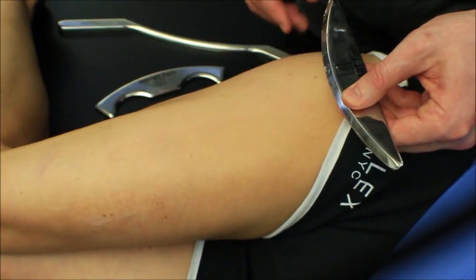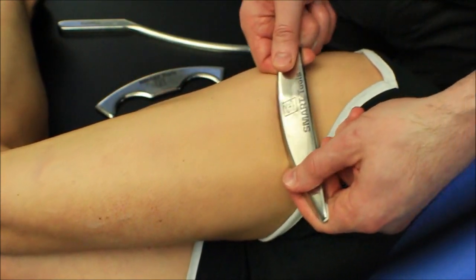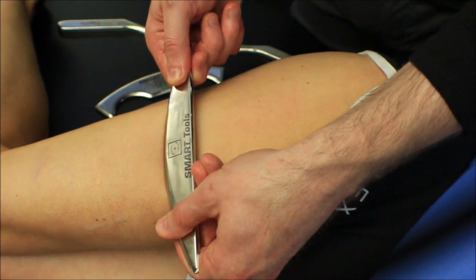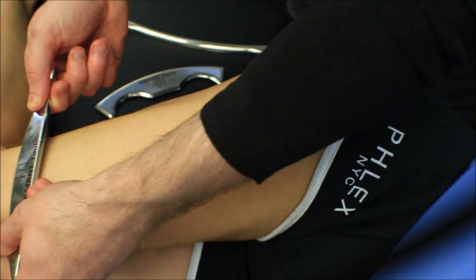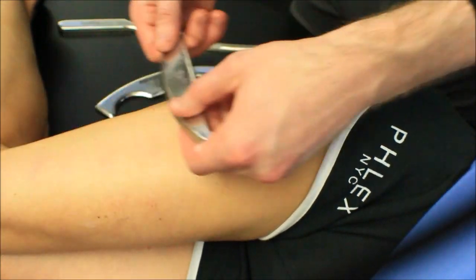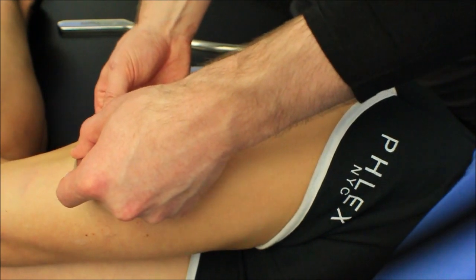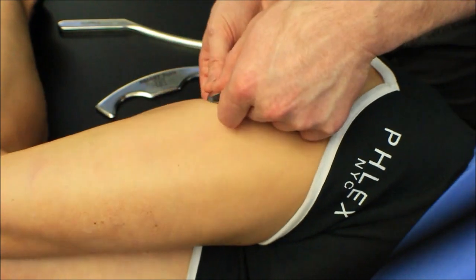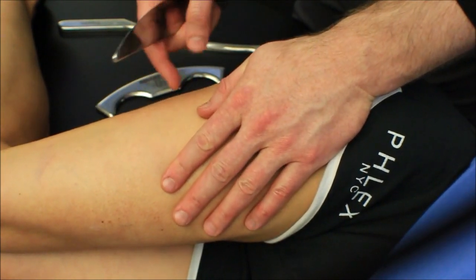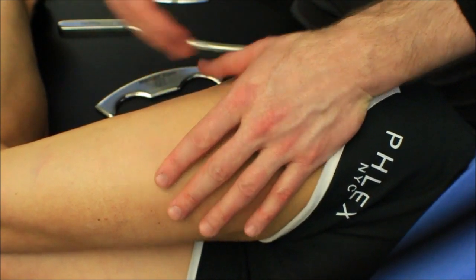We're going to treat the whole lateral fasciolata the same. Starting by scanning — 20 to 30 degrees here on the angle. We're not just scraping skin; we're going to try to pull some of that fascia with us as we pull through the skin, noting any differences in tissue texture. Notice I lightened up a little bit as I went over the iliotibial band close to the knee — you'll start to get a feel for it. There's no need to beat somebody up if you're not going to get an outcome. We got a little tissue resistance in here, so I'm going to use a different tool for the multi-directional breakup.